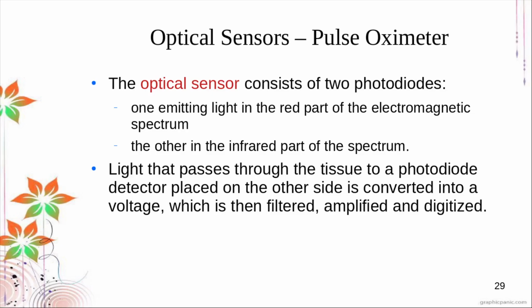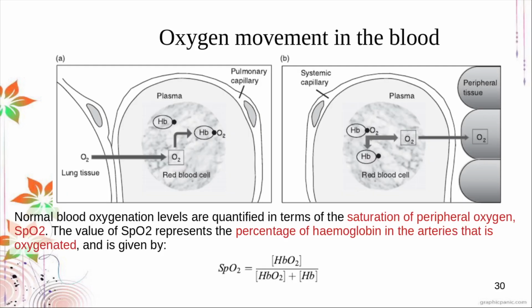The pulse oximeter actually operates on a similar principle as spectrophotometers. So you have a light source that passes through your sample, and then you have your receiver, the one that receives the light source. So, how does it actually work, and how does light allow us to measure blood oxygen levels?